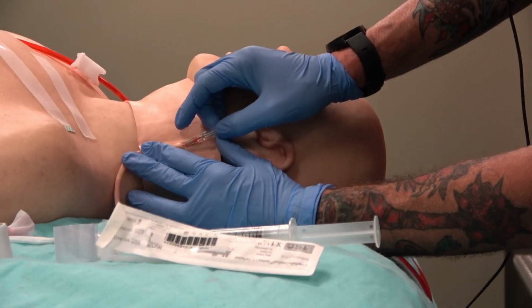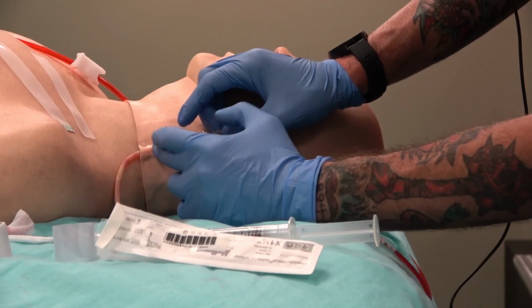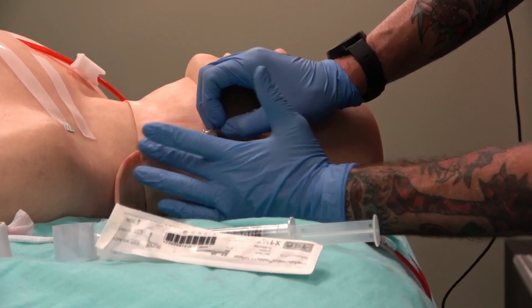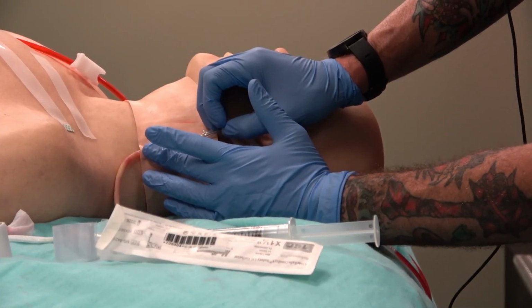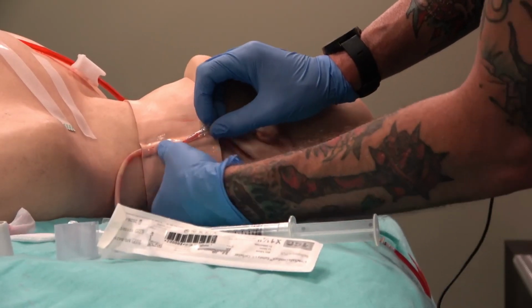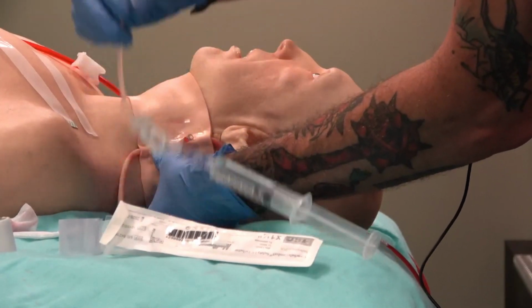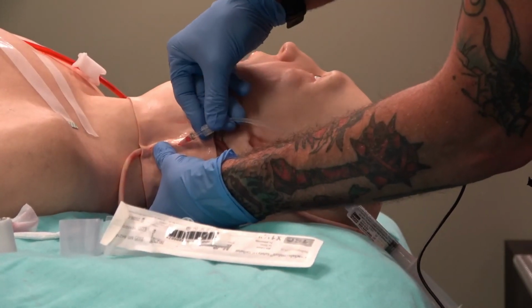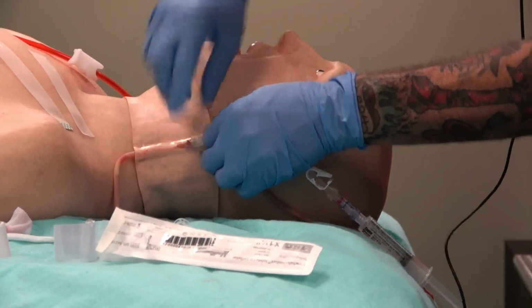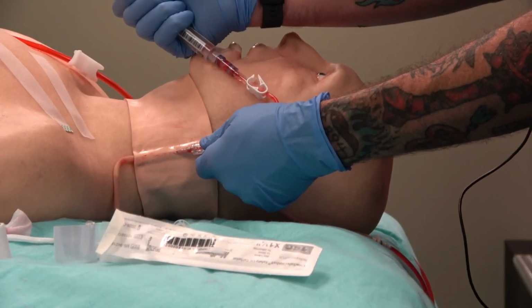There could be a lot of blood here, so I am going to occlude at the base of this catheter. I found that to be a pretty successful way to stop bleeding from coming out, as opposed to going really distal. I'm going to go pretty proximal, just the end of that catheter, all right? And I'm going to put pressure there. Okay. Got my drawback.